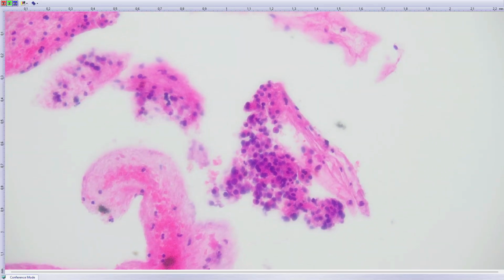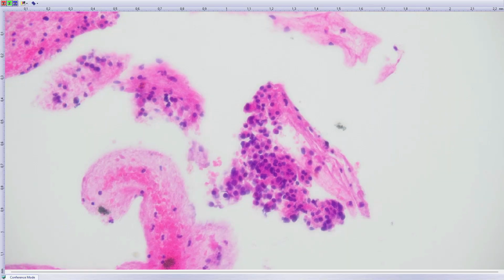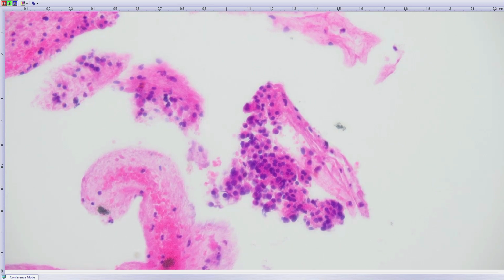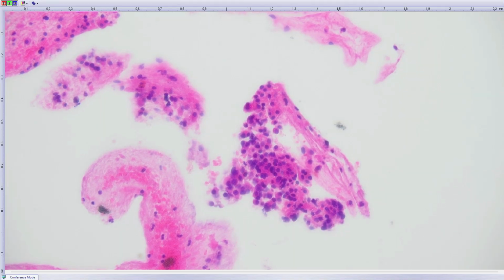And the patient is female, so this broadens the differential diagnosis a little. With morphology like this, it can be a well differentiated neuroendocrine tumor, it could be a solid pseudopapillary neoplasm, and it could be an acinar cell adenocarcinoma, right?